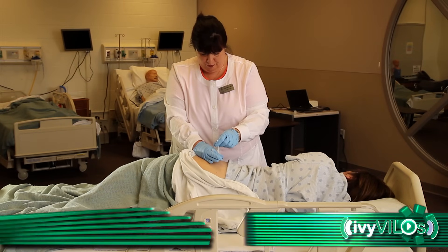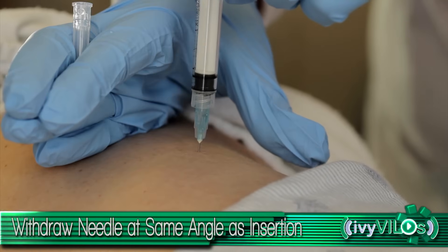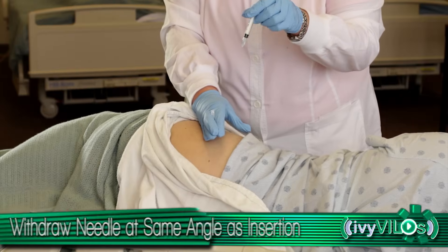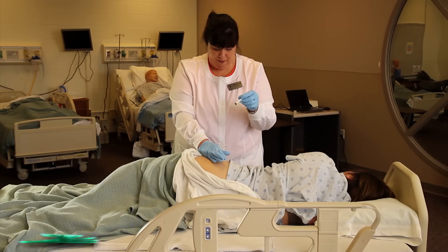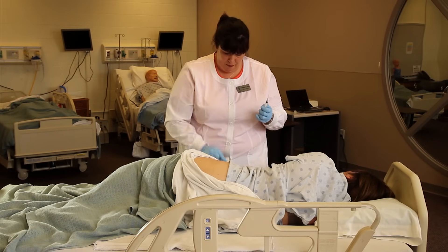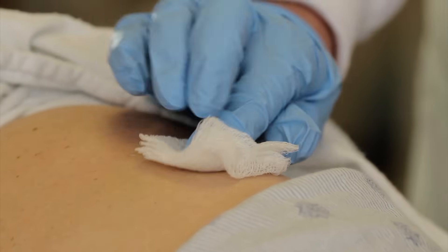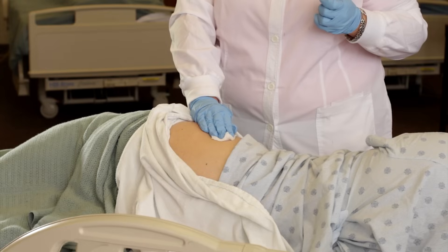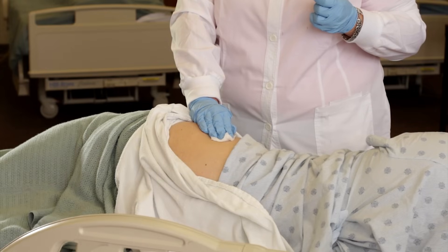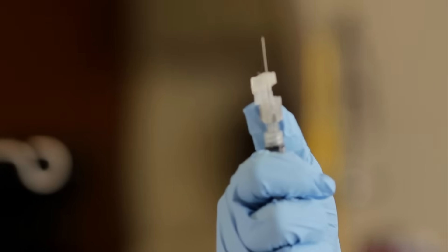Withdraw the needle smoothly at the same angle of insertion. Apply dry gauze with gentle pressure. Do not massage the site. Do not recap the used needle.